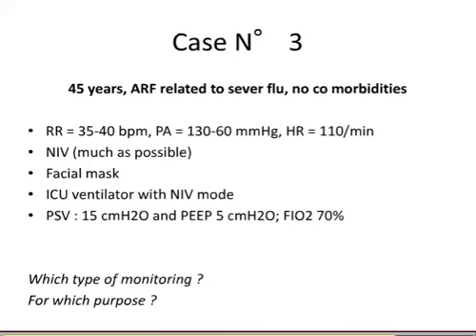So thank you for the discussion. Maybe because it was mentioned, if you use an ICU ventilator, as Philippe said, please switch on the NIV mode and use the monitoring facilities, because they monitor the leaks, the amount of leaks, by comparing expiratory to inspiratory tidal volume. This is very useful.